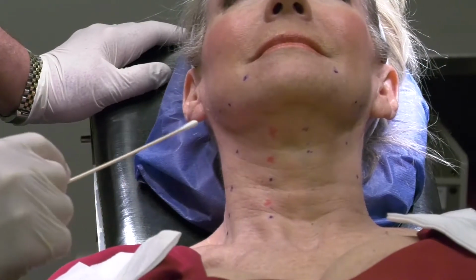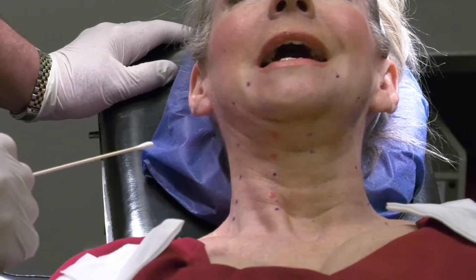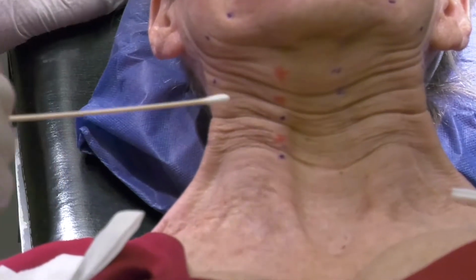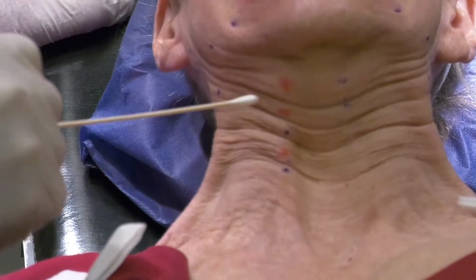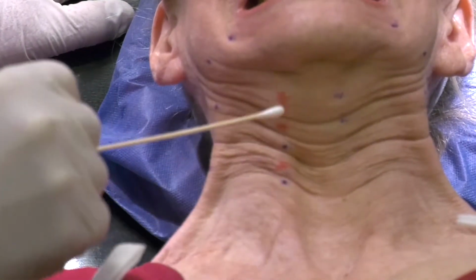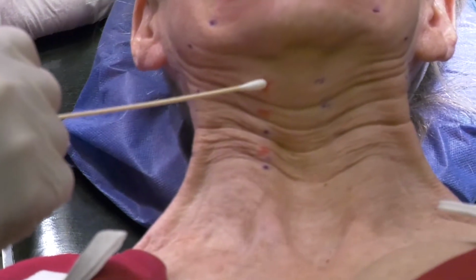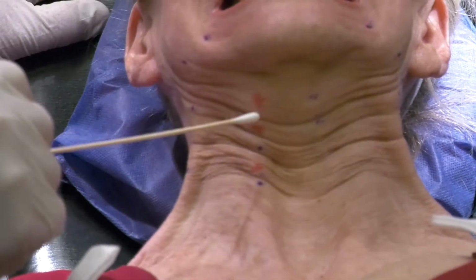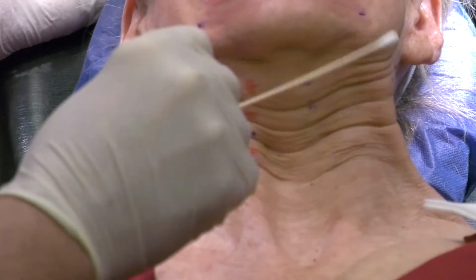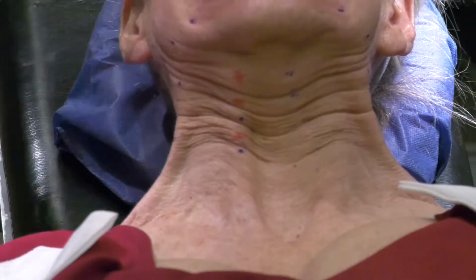What I have done is, if you can animate, Barbara, please just really say E, really hard. You can see the tremendous pull of the platysma, especially on the right side, the lateral band and the medial band, less so on the left. And what I have done is marked 2 different colors. The colors in red will represent 4-unit injections, and the colors in blue, as you can see, it's 2-unit injection of Xeomin per point. Relax, please.